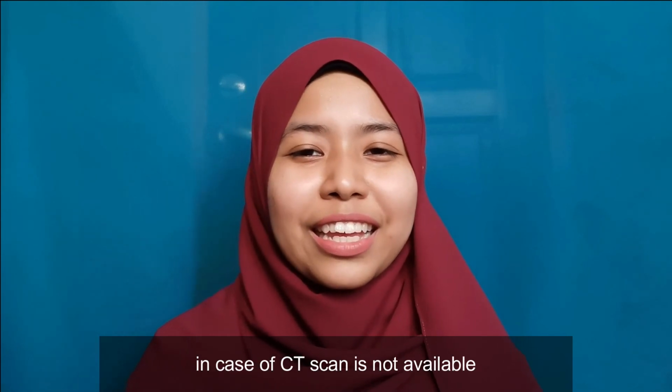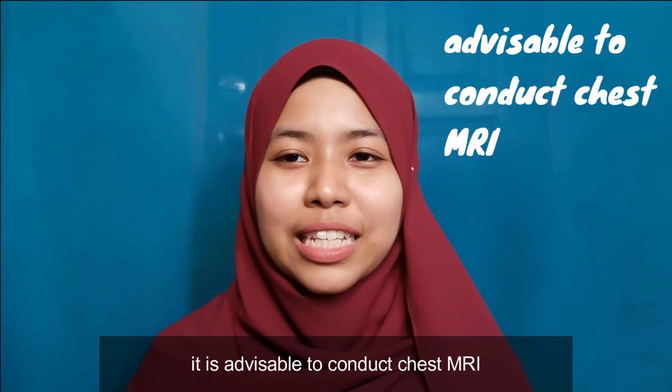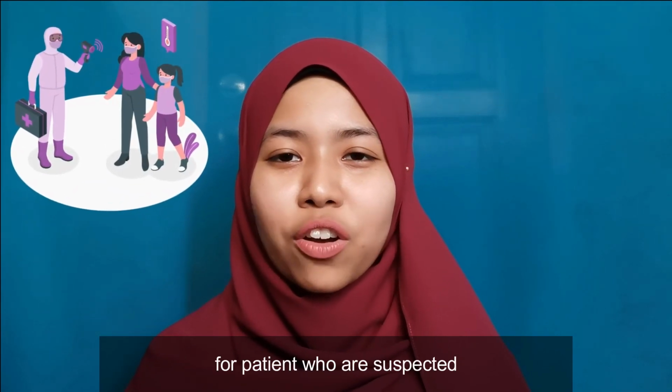To add on, in case CT is not available, it is advisable to conduct a chest MRI for patients with suspected or confirmed COVID-19.